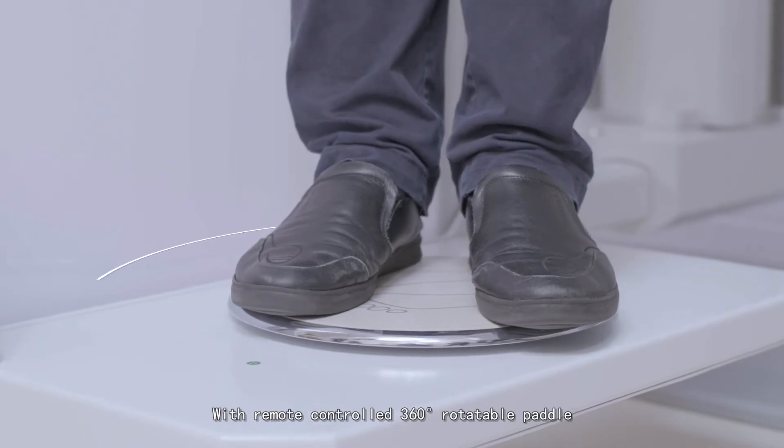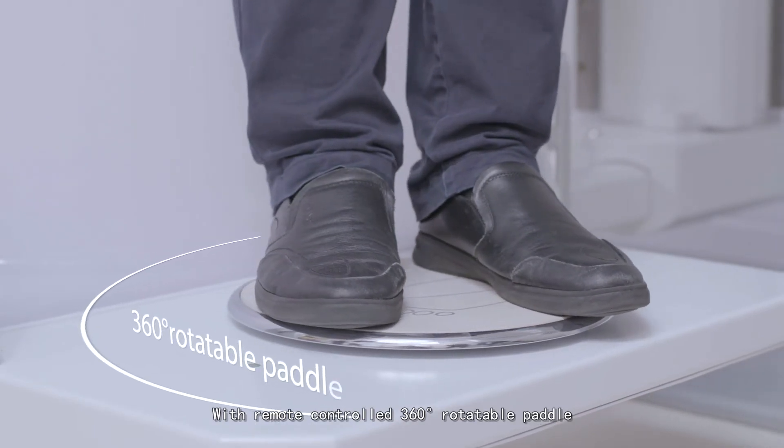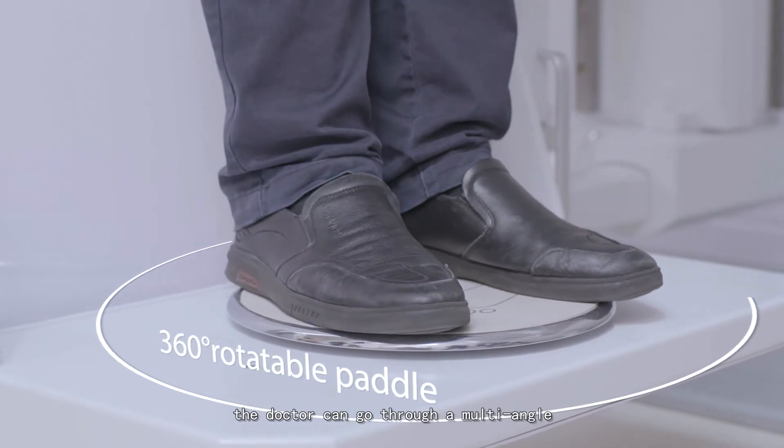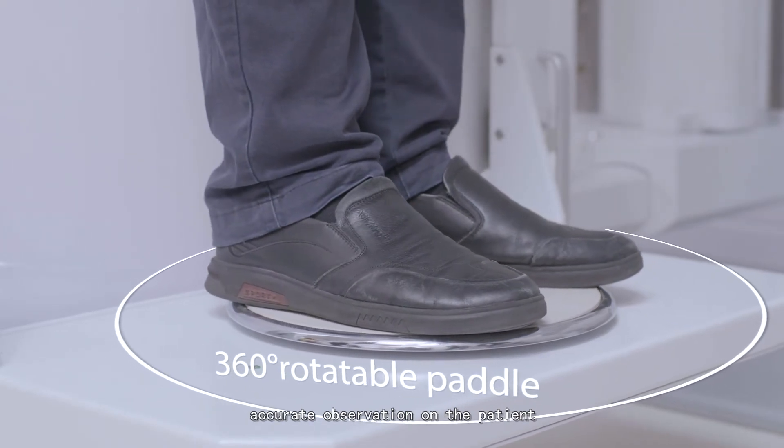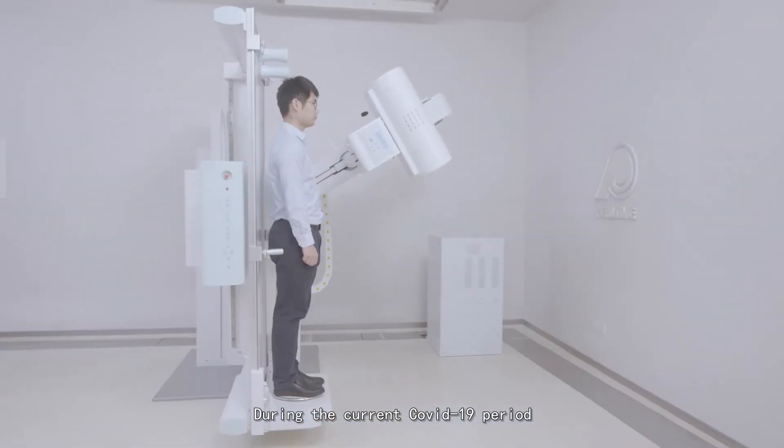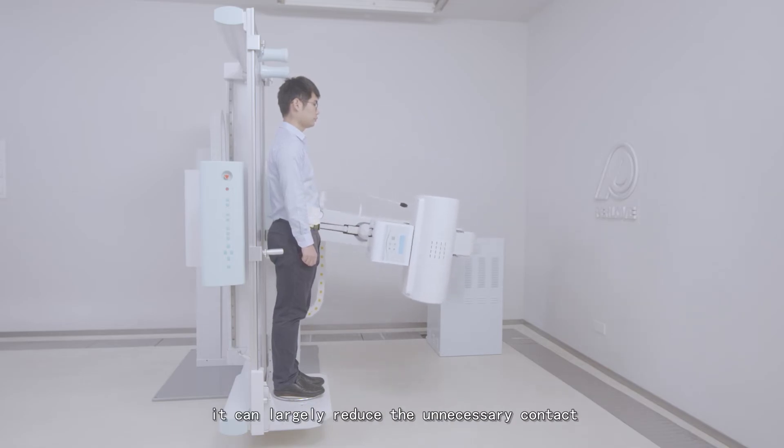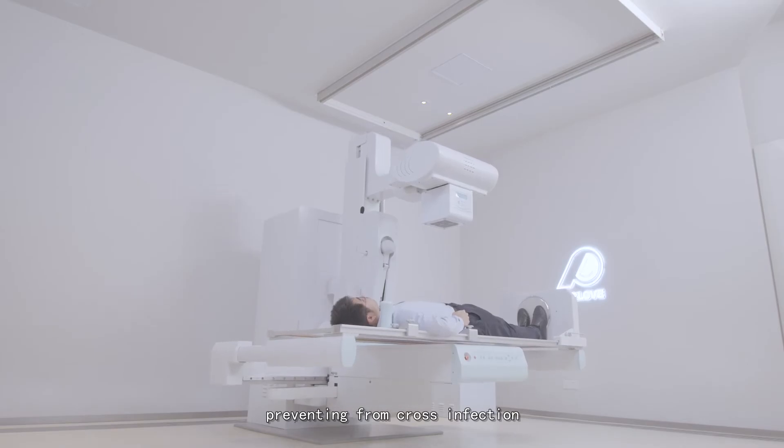With remote-controlled 360-degree rotatable paddle, the doctor can perform multi-angle, accurate observation on the patient. During the current COVID-19 period, it can largely reduce unnecessary contact, preventing cross-infection.